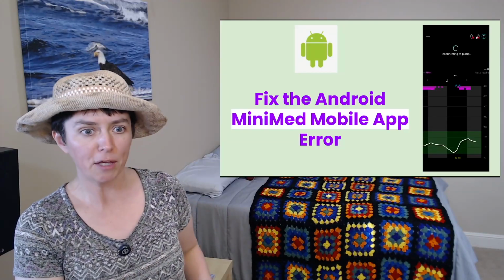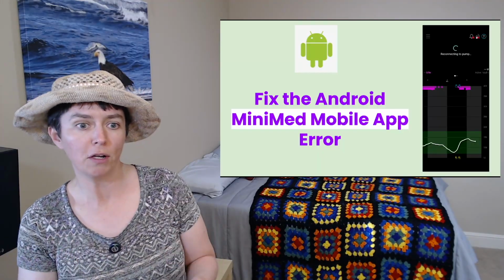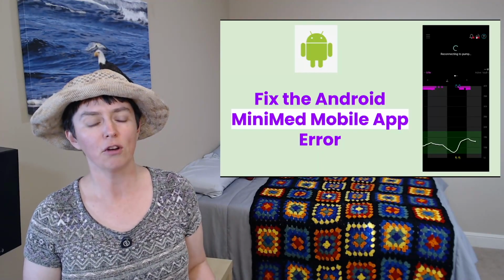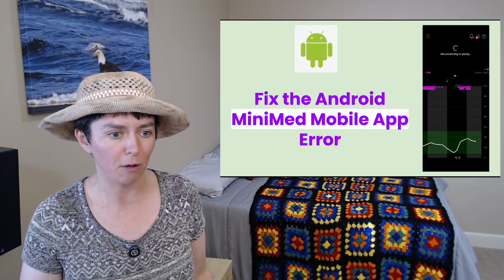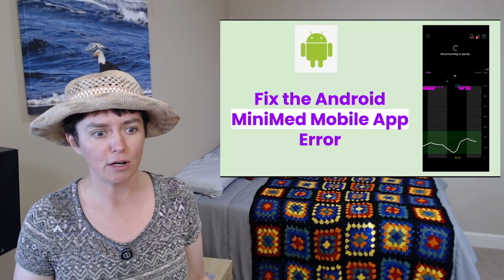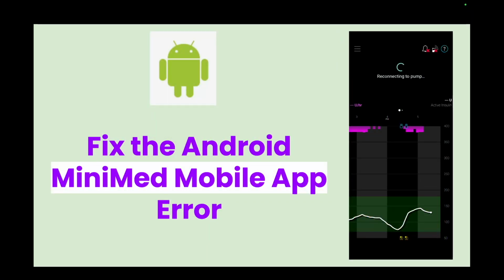And this is the application I use on my Android phone so that I can see my blood sugar on my phone and also on my watch. So when it stops working, it's super frustrating. But fortunately, sometimes or often there's just like three really quick, fast things to do that solves the problem. Unfortunately, I have to do this fairly often. I guess there's a reoccurring bug. So let me share this with you, and I hope that this will fix the problem for you.